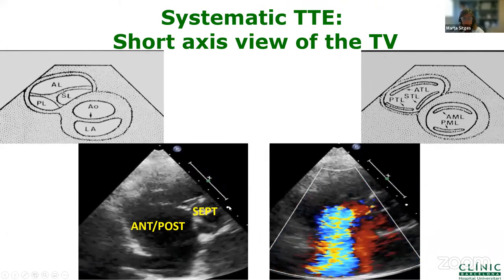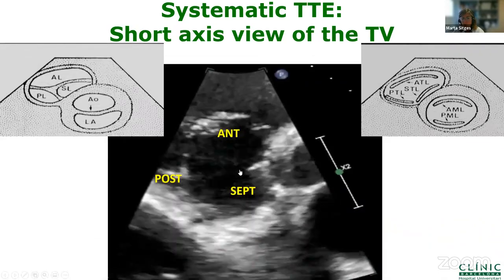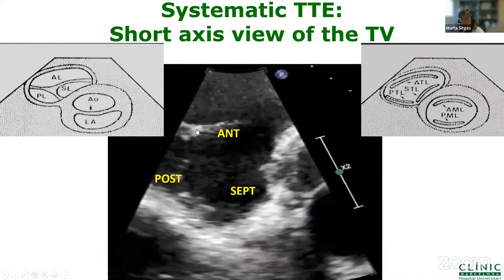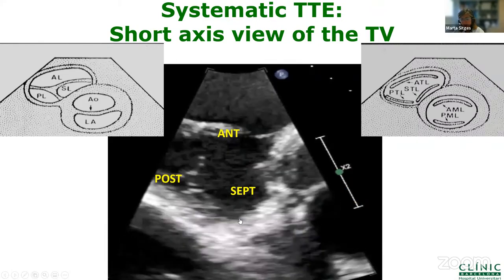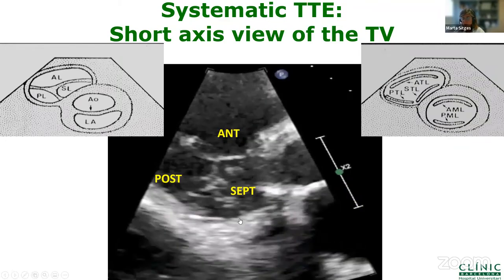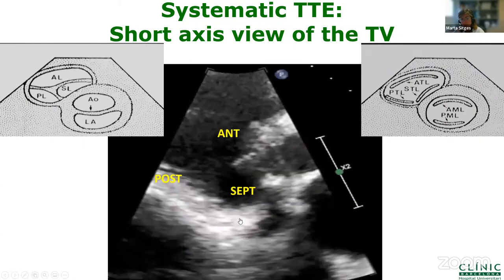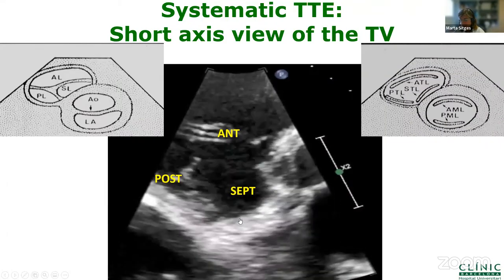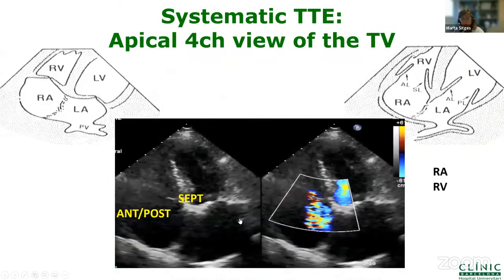Also, the short axis view, where we have the aortic valve in the middle, and even from transthoracic, we can get a hint of a short axis view of the tricuspid valve, where we have here the aortic valve, here we will have the septal leaflet, the posterior and the anterior. So it's just a little bit of playing with the transthoracic probe. This is very important to screen patients, but also sometimes helps during interventions to complement the information of esophageal echocardiography. Sometimes you have doubts and transthoracic might be very, very useful.